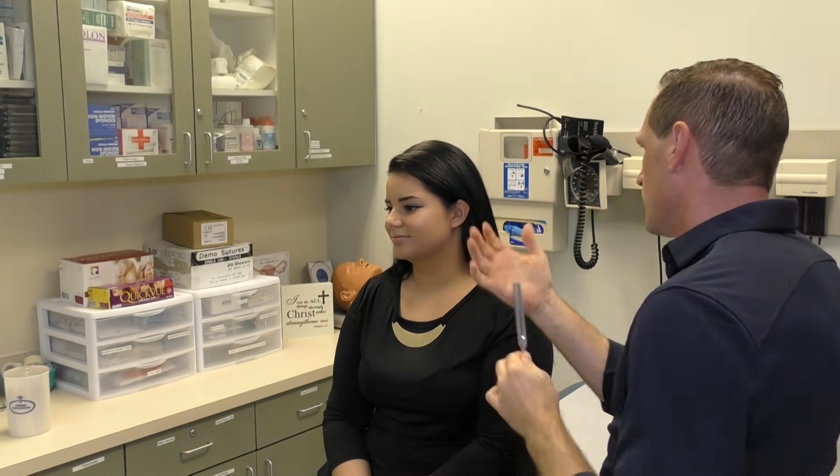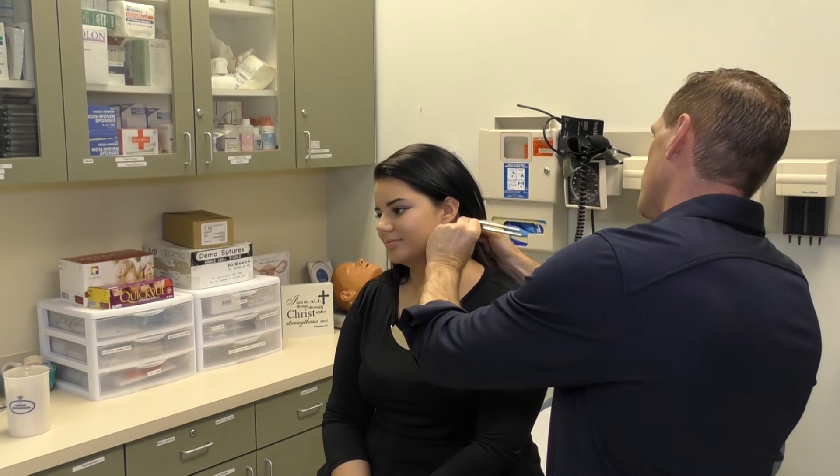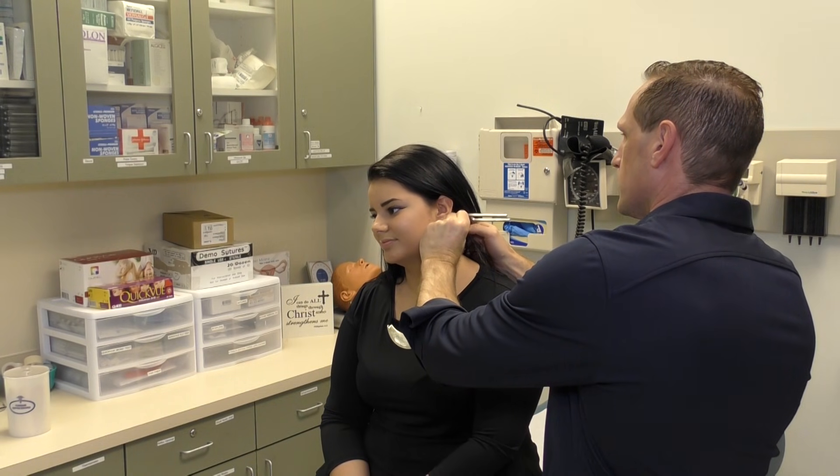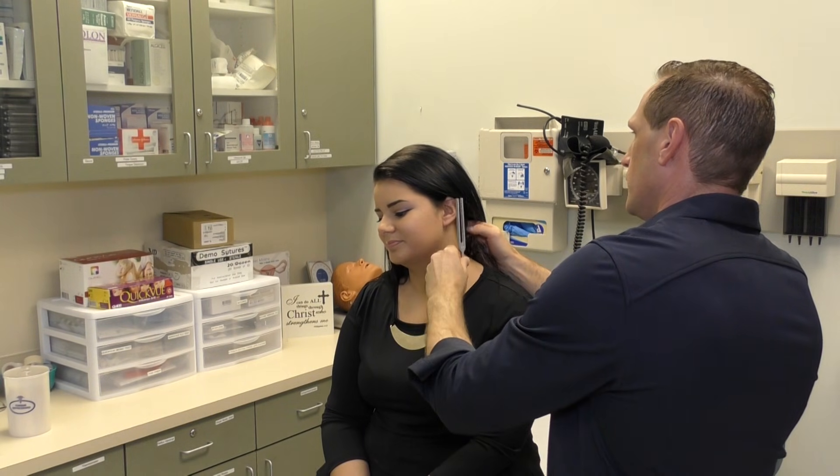The other test is the Rinne test. Come to the patient's side, tap the tuning fork, and press it against the mastoid process. Ask them to let you know when they stop hearing it, then move it to the front of the ear and ask if they can still hear it. Bone conduction should last less time than air conduction — generally you expect to hear twice as long through air as through bone. If you hold your ear and sing, you hear yourself differently because you're hearing through bone conduction once you occlude the ear.